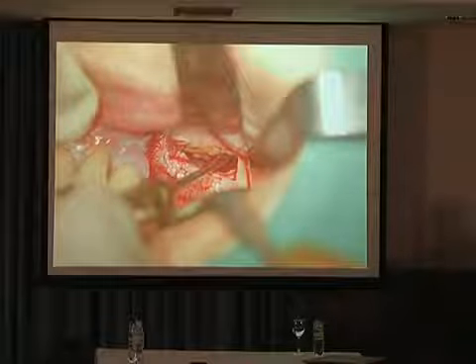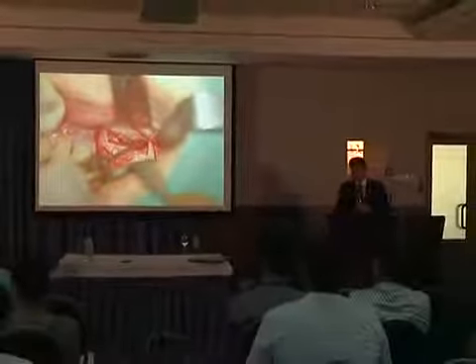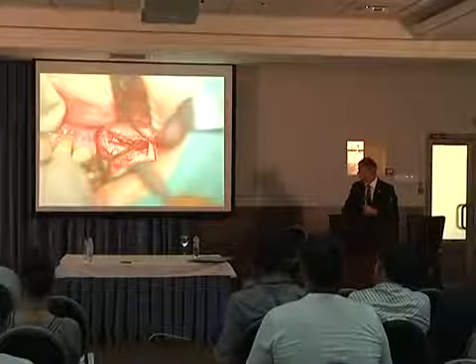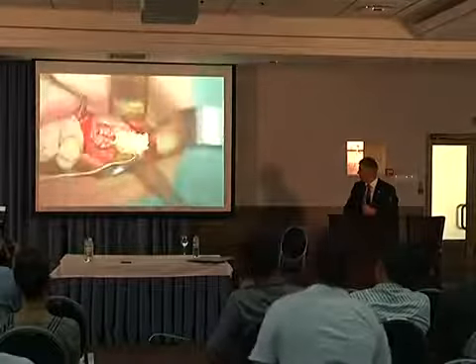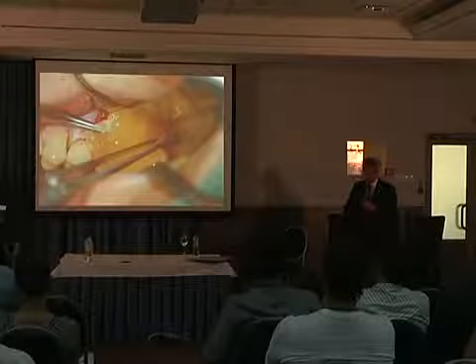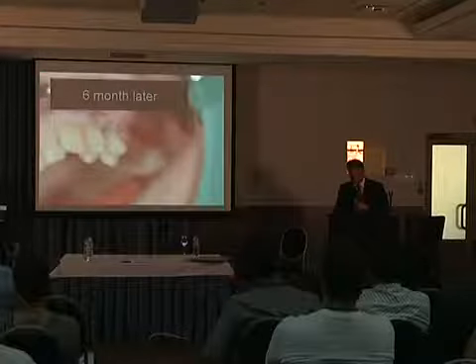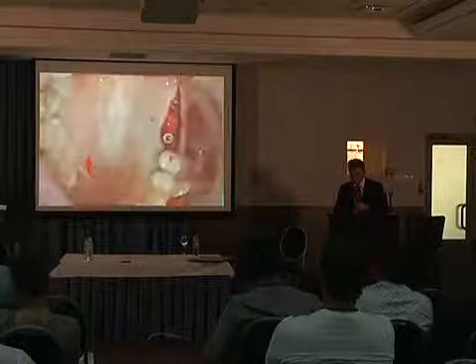Она прилипает. Дело в том, что она прилипает к мембране Шнайдера, когда он подкладывает ее снизу, и дальнейшее наложение любого костного материала защищает мембрану от любого риска перфорации. The bios. Биос, смешанный вот с этим гелем, да. Накладывание окна на место, опять фибриновая мембрана. Two times, so no comment. И швы. 6 months later, implant. Через 6 месяцев открытие, установка имплантатов.